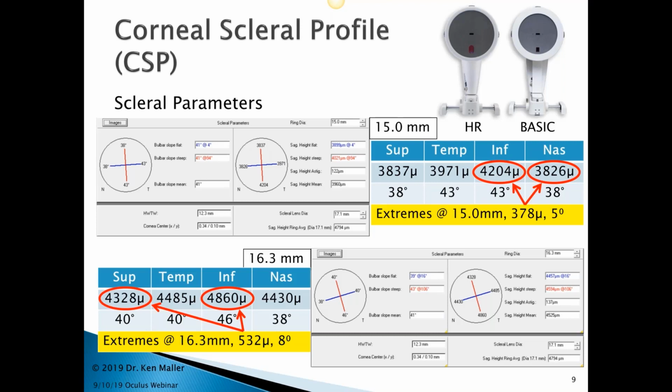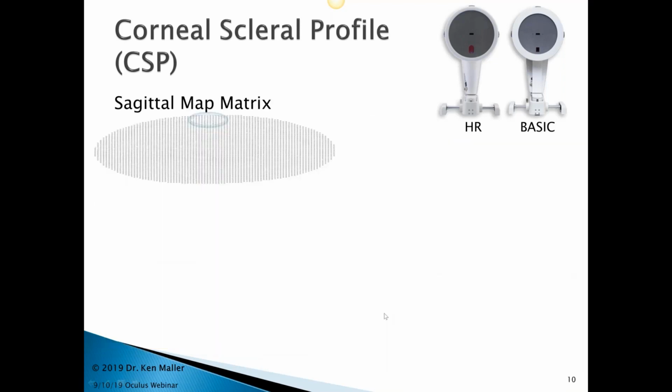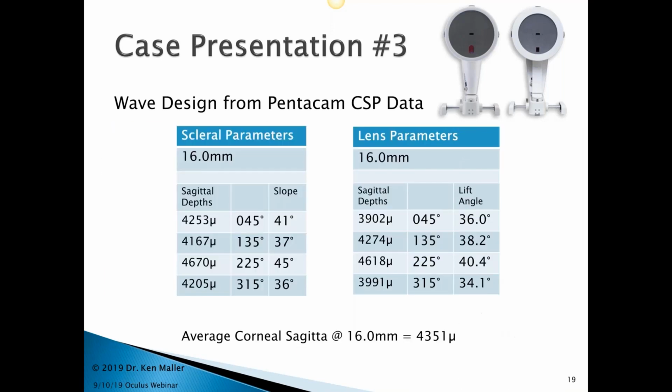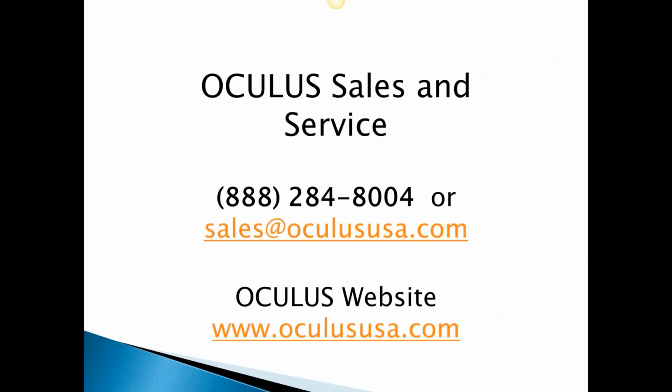Okay, thank you. Our next question is, besides using a second set of hands, do you have any other tips for acquiring better images, especially with a superior scan? Six months of trial and error? The answer is no. I tried every single way to do this by myself, and I absolutely positively was stymied no matter what I tried to be able to get really, really good scans.